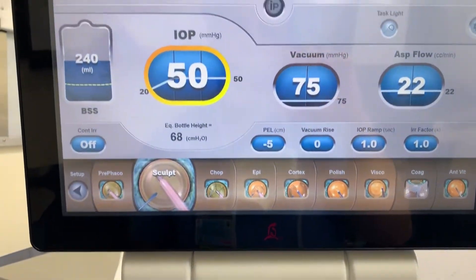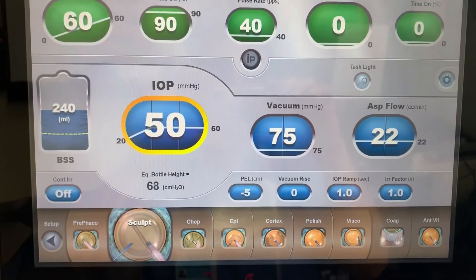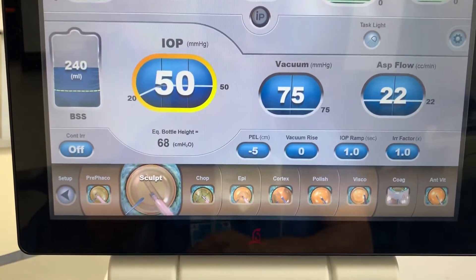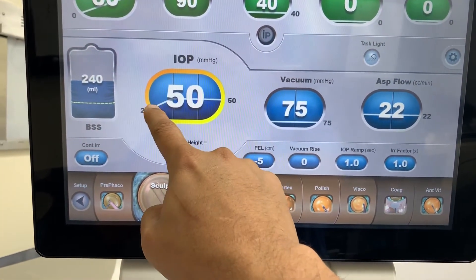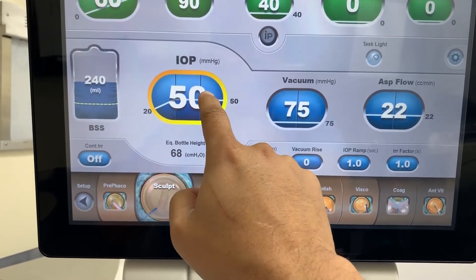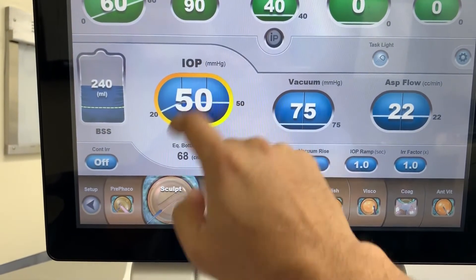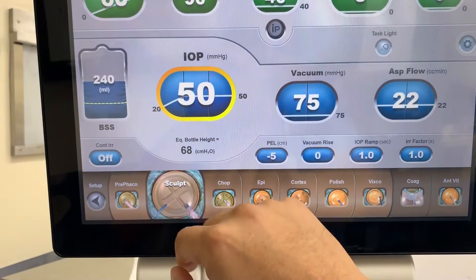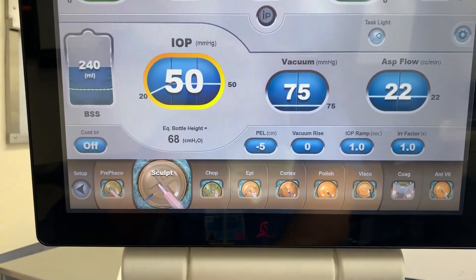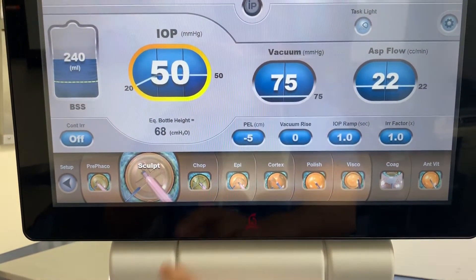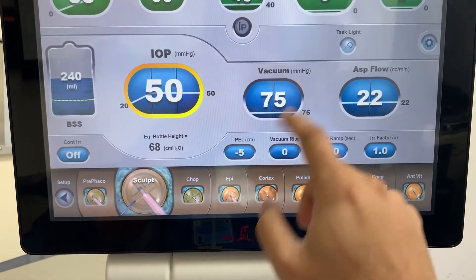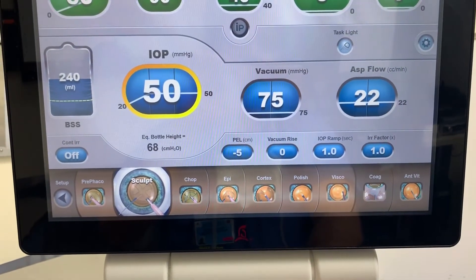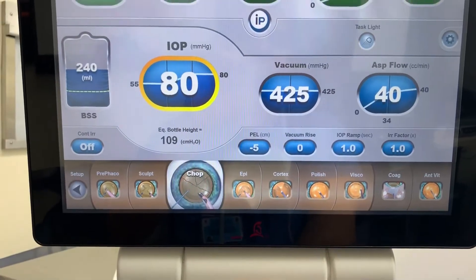Sculpt mode: sculpting the nucleus is a more common setting for surgeons doing divide and conquer. We ramp up the infusion pressure to about 50 millimeters of mercury — equivalent to a bottle height of about 68 centimeters. Then a reasonable amount of vacuum and a little bit of flow as well.